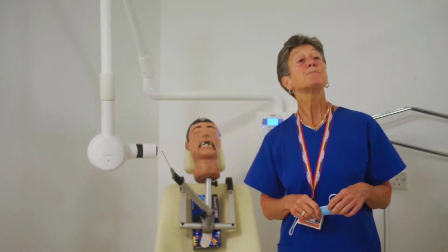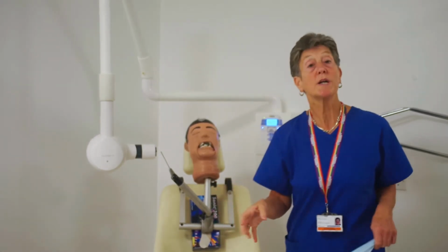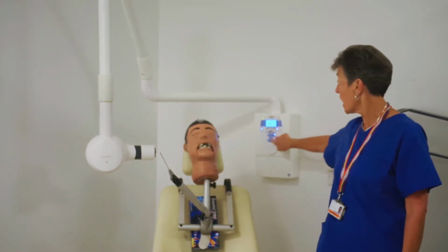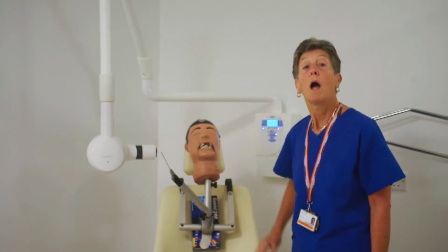Anything else? Selecting the right exposure factors. Absolutely. So before you actually take your radiograph, make sure that you've got the correct exposure time for the area that you are looking at. Anything else?